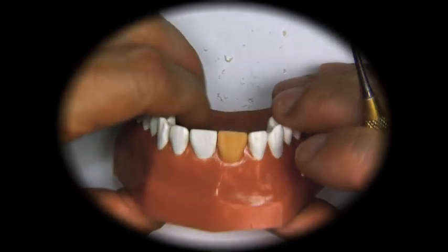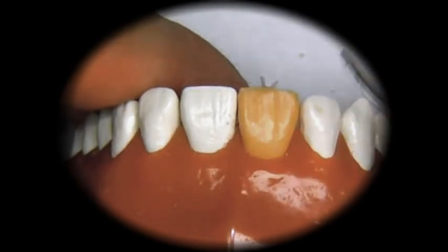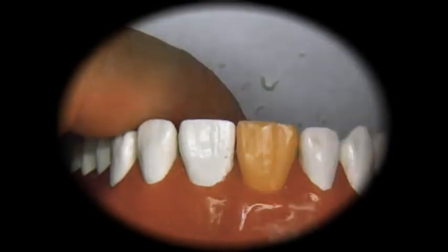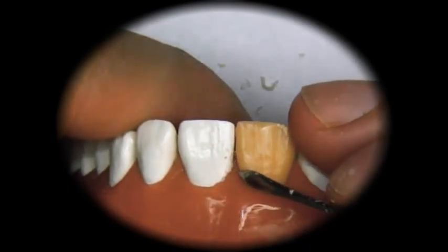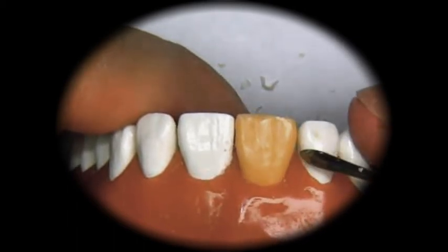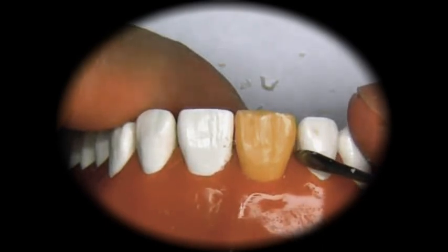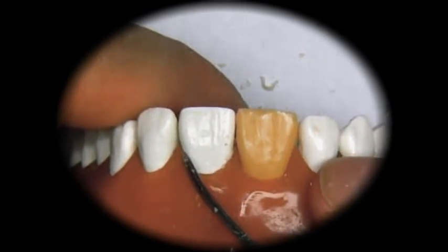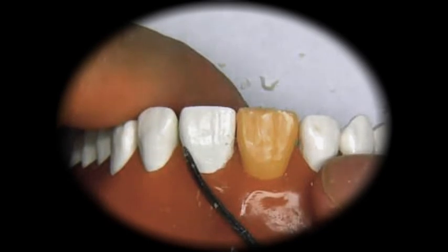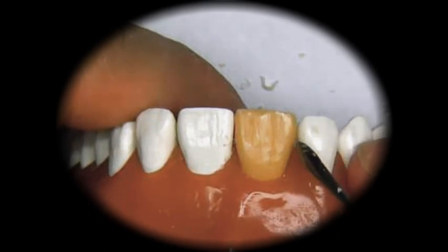Now we can further improve this shape by really observing these curves. Here we can bring this down slightly, make it a little bit rounder here. And we can bring this round shape a little bit further down towards the gums. You see how this curve here kind of ends at the junction of the middle third and the gingival third. So we can do the same thing here.